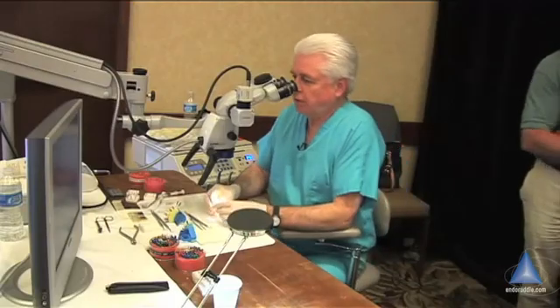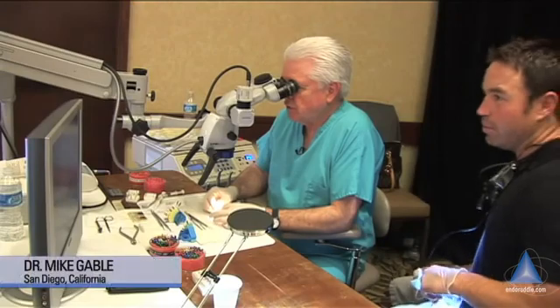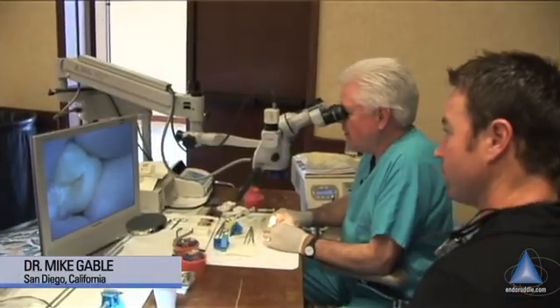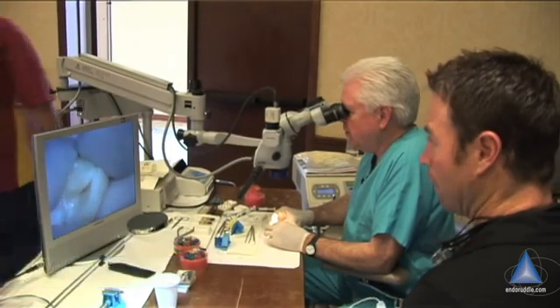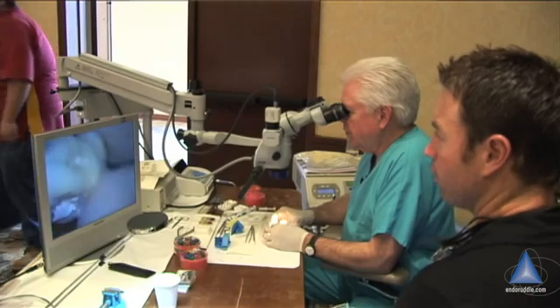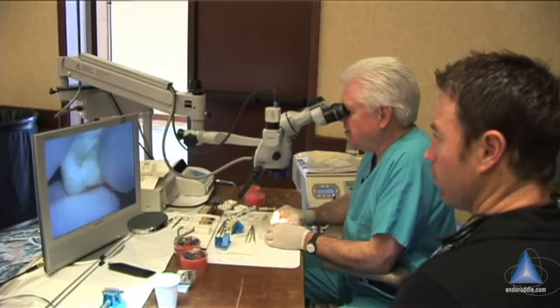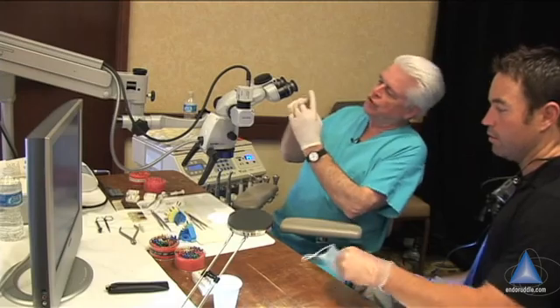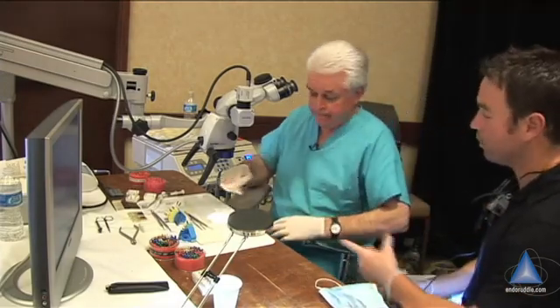Okay, have a seat. I finished three of the canals. I know that there is an MB2 just by looking at the root. I visually see that one — it's a little short, a millimeter. Are you having trouble finding patency in this root? Because it's got concrescence — it's fused to the other root. Sometimes when two roots fuse and join, you never get patency. Yeah, that one I don't think I will.